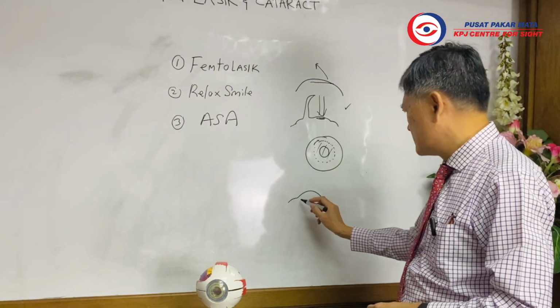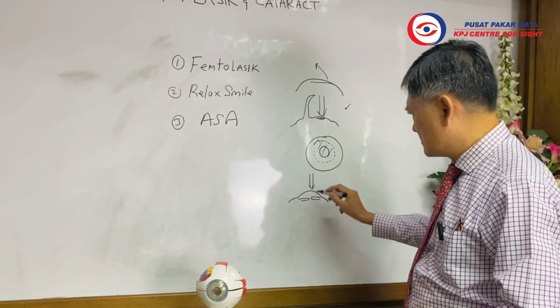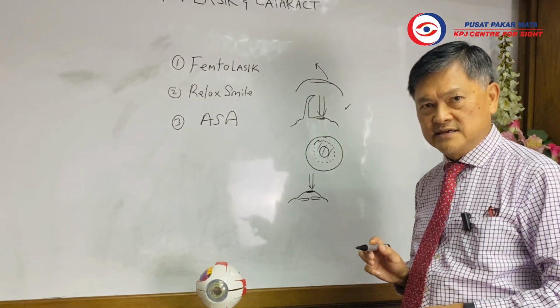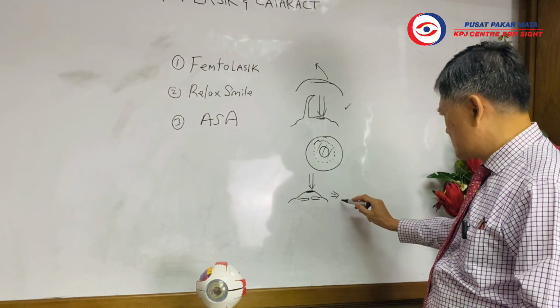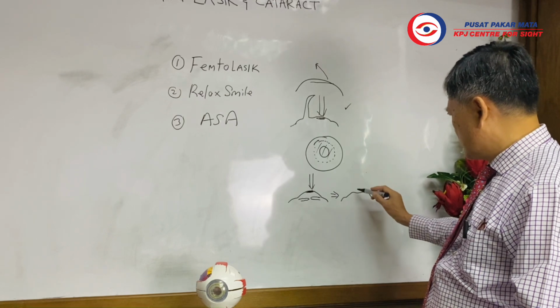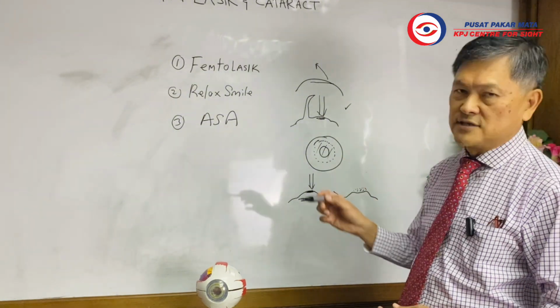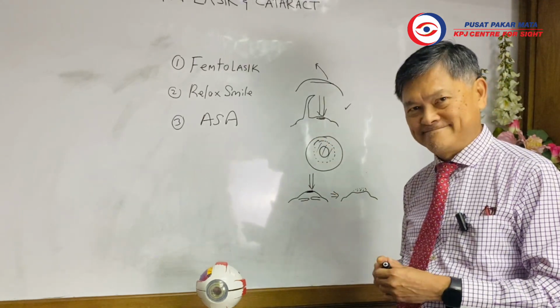Cross section. Okay, this is the pupil. The laser is applied directly onto the cornea surface, and then it removes the tissue layer by layer. So what happens is, at the end, let's say it's a short-sighted eye, it will become like this. Okay, so this part of the cornea is removed by the laser. So these are mainly the 3 types of laser vision correction procedures.